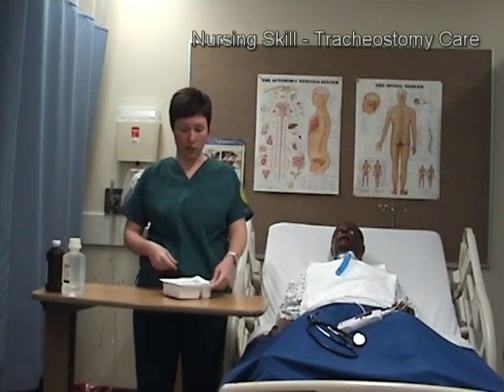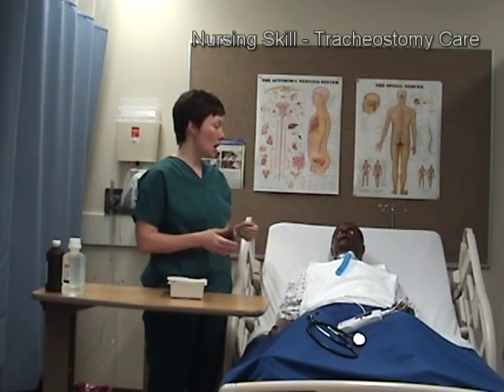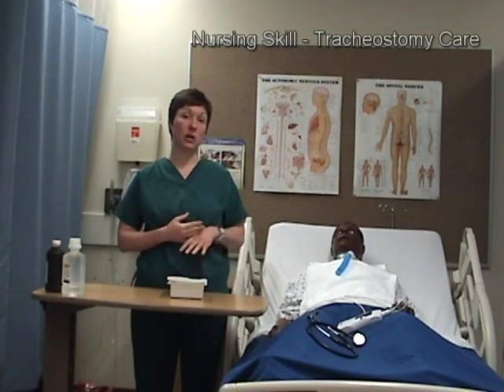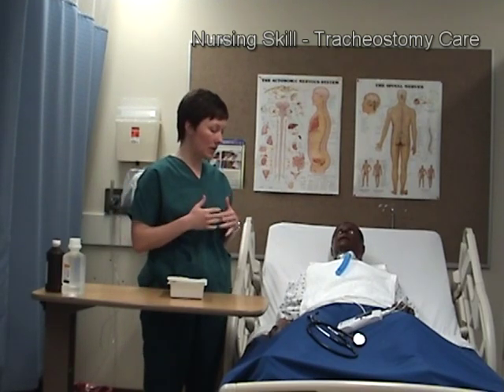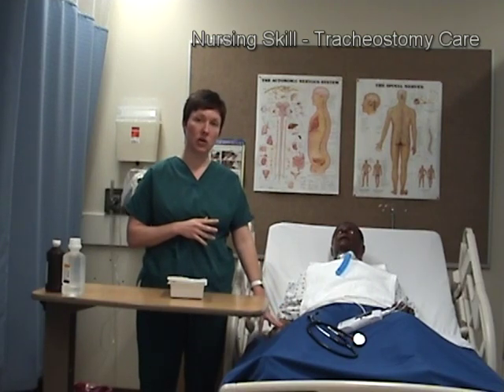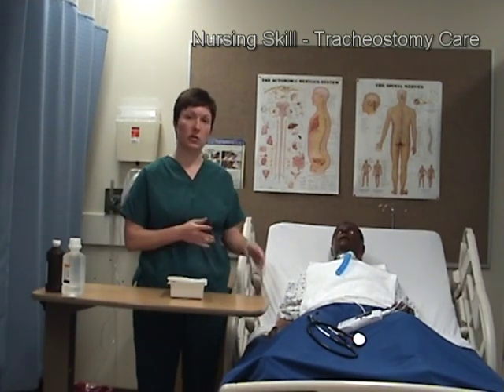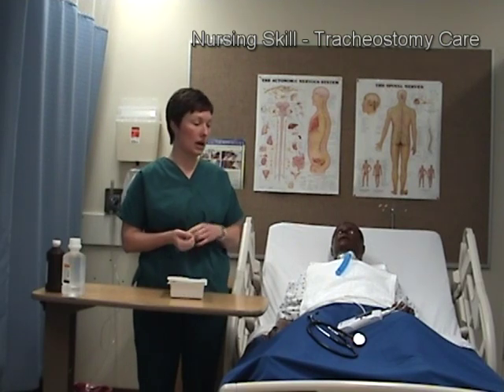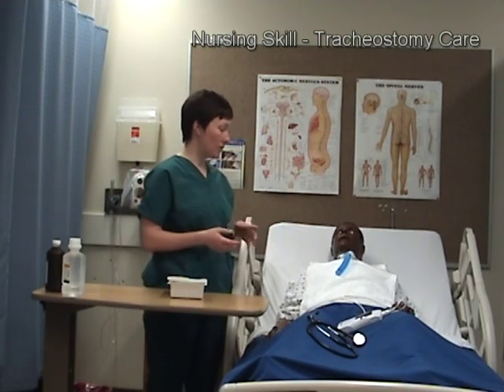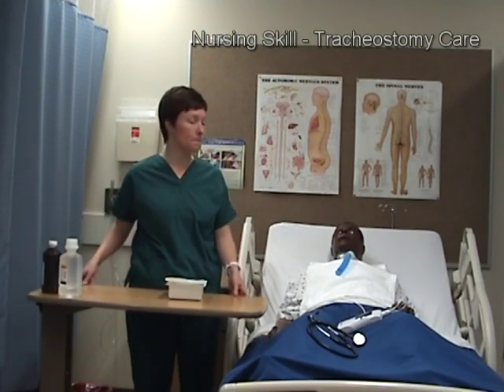I'm going to be performing a tracheostomy care on this patient. Before coming into the room, I have reviewed my doctor's orders. I have come into the room, verified that I have the correct patient, and I am performing the correct procedure. I'll do my two patient identifiers and introduce myself to the patient after I've already collected all of my supplies for the treatment.